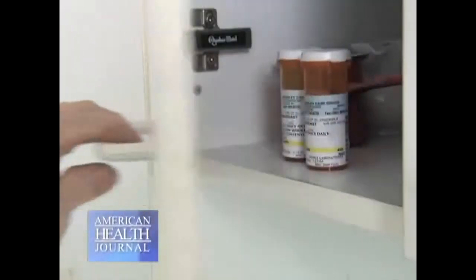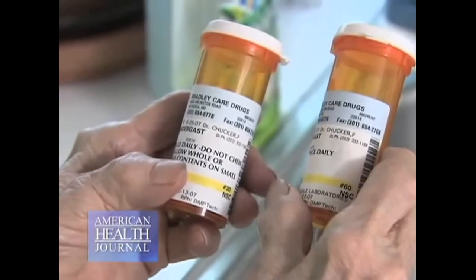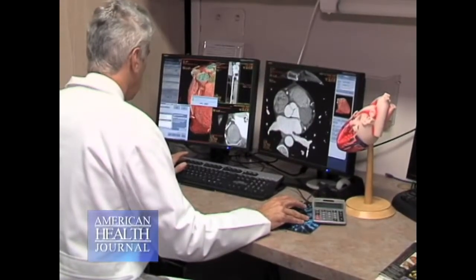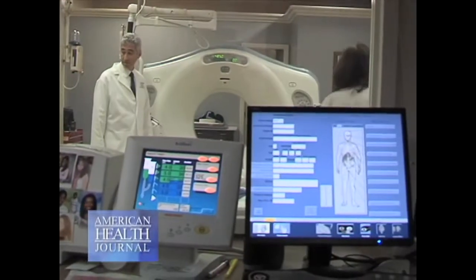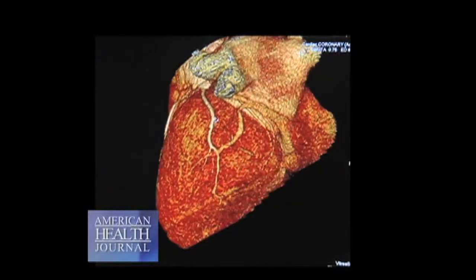The next test that we developed was a non-invasive angiogram, where we can actually see the percent blockage with over 90% accuracy, and we can detect the amount of plaque. So what I'm trying to do now is to validate the plaque test to get a volume of plaque. So you can know how many milliliters of plaque you have in your coronary arteries, and then we can track that over time. So I can look at, is your statin dose correct? Is your blood pressure pill the best one for you? By saying, you know what, over the past 2 years, your plaque has gotten worse, your regimen is not correct. So actually be able to validate that we're doing the right things for the patients, that they're under the proper care. And we're doing a lot of validation work right now looking at this non-invasive angiogram with the CT scanner to prove that it's the best way to track plaque over time.